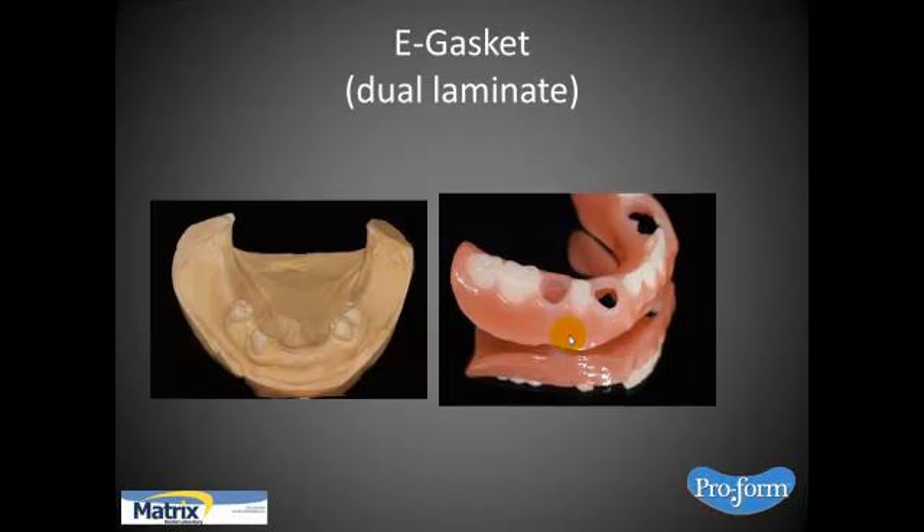Here it is — just to show you a model and then the end result, to give you an idea of where we're going with this. It's called a dual laminate. By the way, there are other dual laminate materials out there that come in thicker sizes and can be used for a host of other applications where you'd like to have acrylic adhere to it — we can talk about those on another video.